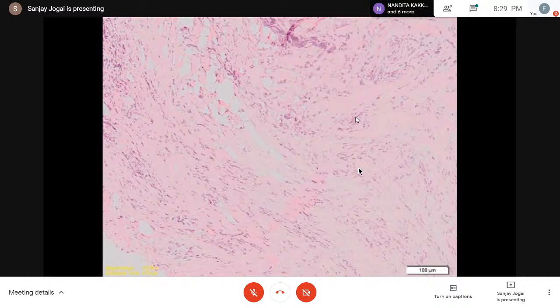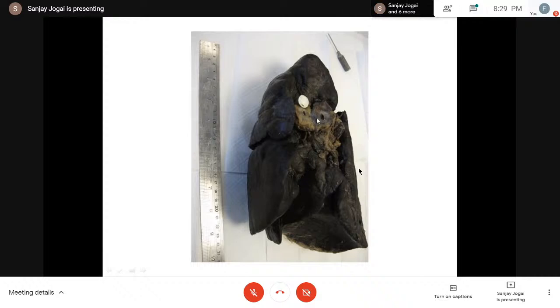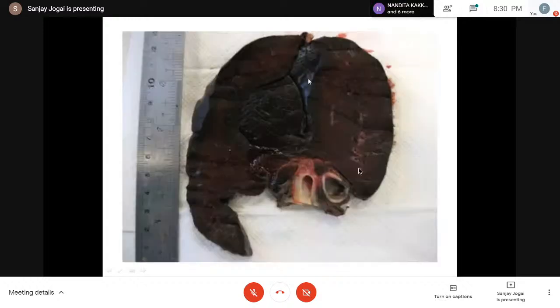So the surgeon said, the lung is anyway gone, which I'm sending you in a bucket, so we are going for a pneumonectomy. And you can see in the following pictures that the lung indeed was gone. This is how the lung looked. It was just like a ball of hemorrhagic, just a balloon of blood. And I'll share with you a few more pictures. So that's the lung, and I've just sliced at the pulmonary artery, and you can see a very circumferential tumor or tumor-like growth. Look at that. So the pulmonary artery is almost like a chink-like space, and the whole lung is sort of infarcted, hemorrhagic. That was the cut surface of the lung, just a bag of blood almost.